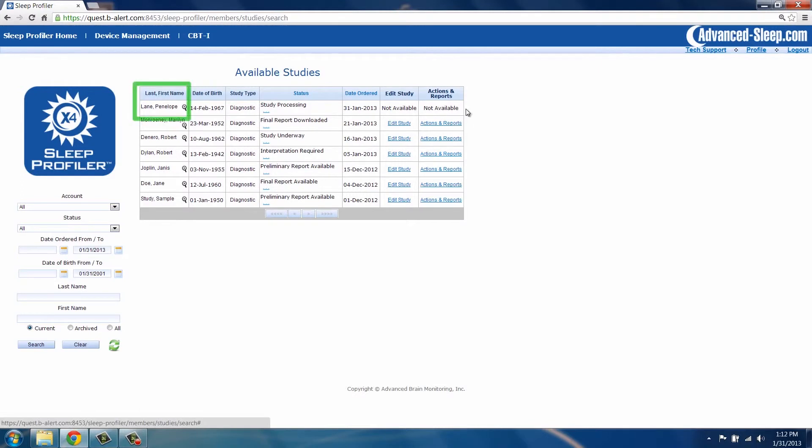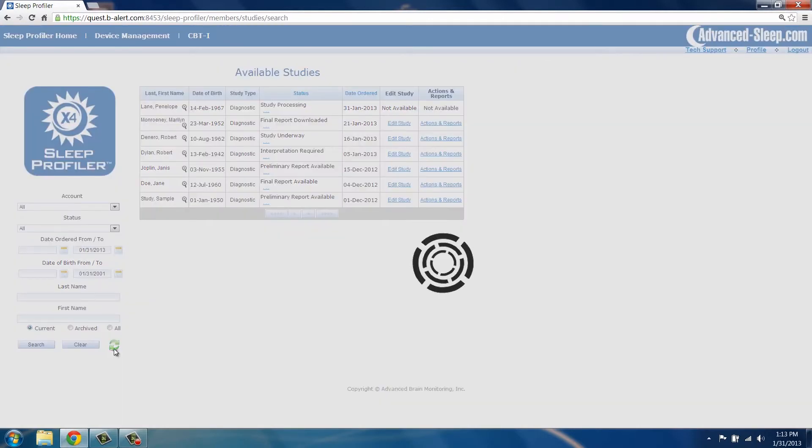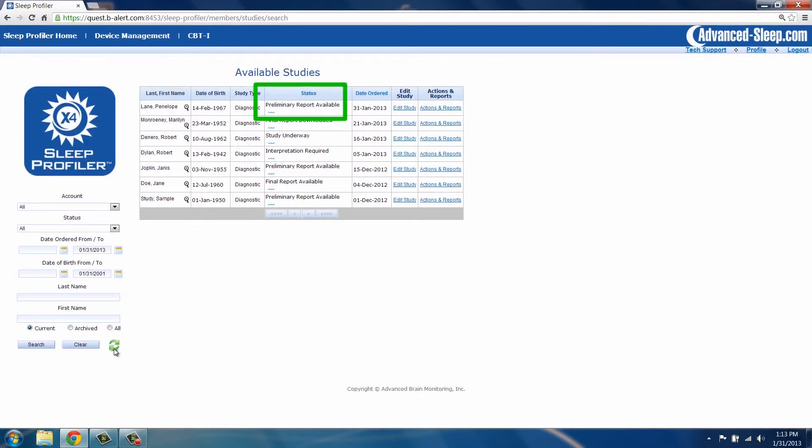Locate the patient name on the available studies list. The status Study Processing is presented. After a few minutes, click the Refresh button to see the status change to Preliminary Report available once processing is complete.